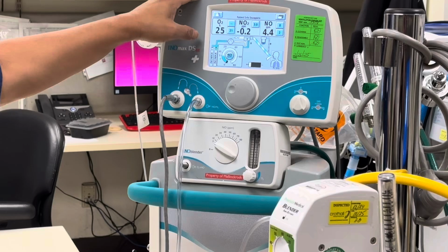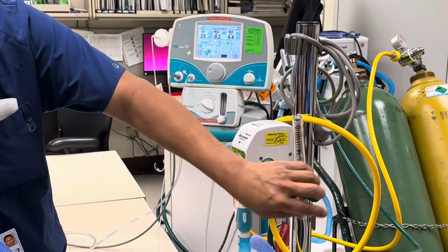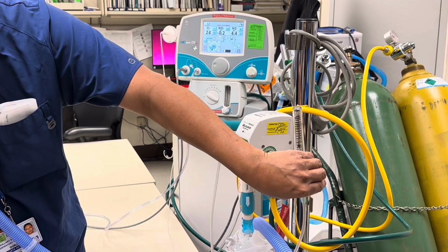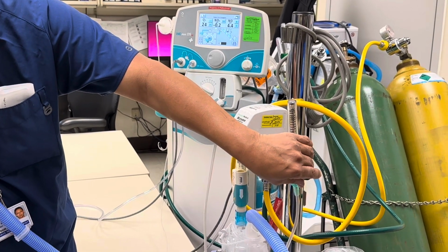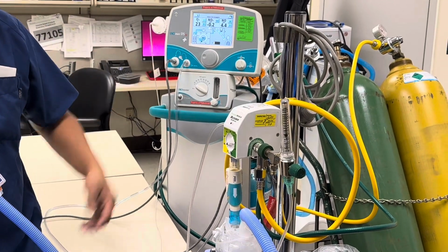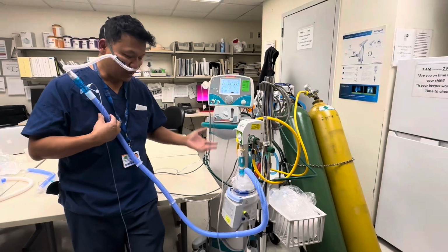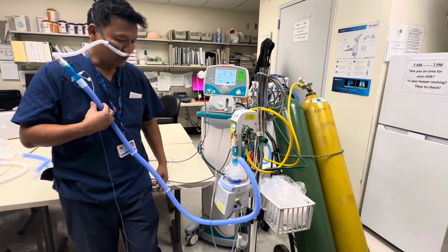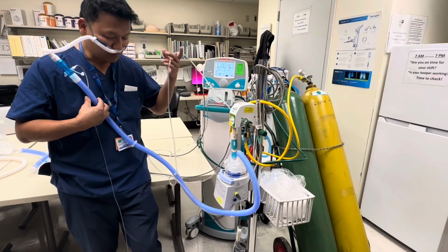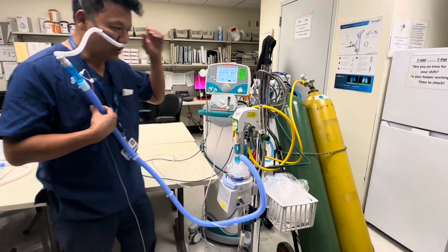And it's reading 28% because we give it 28%, and they want not too much flow. So maybe 2 to 4. So that's it. Now the patient's getting 5 parts per million, and this is a cannula setup that we came up with. This is not OptiFlow, it's a regular cannula setup. So that's what we're doing. All right.